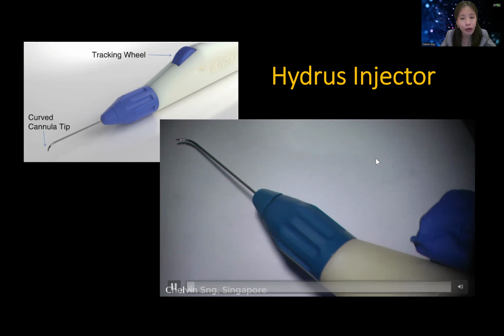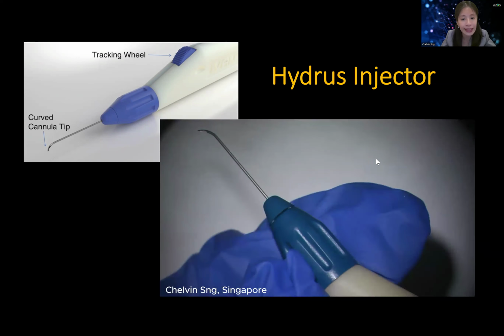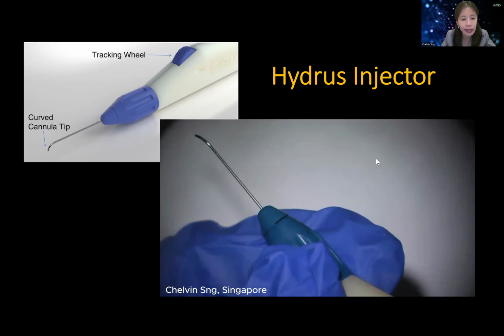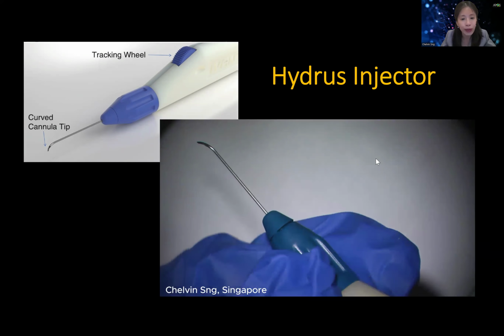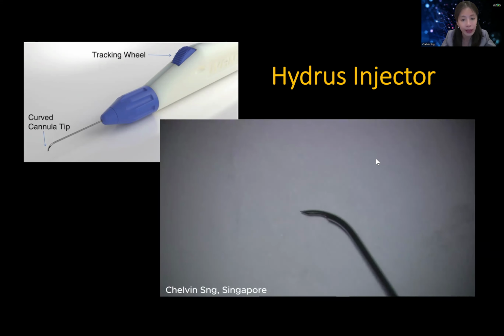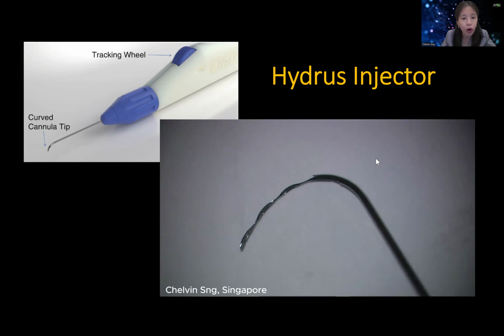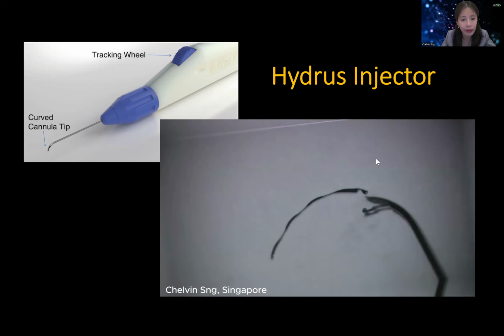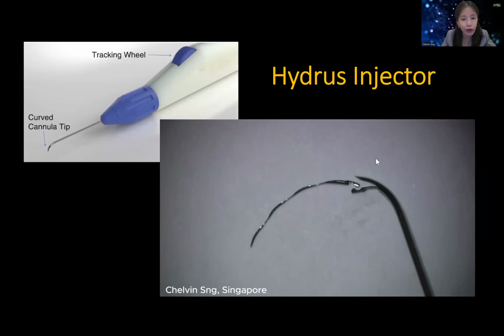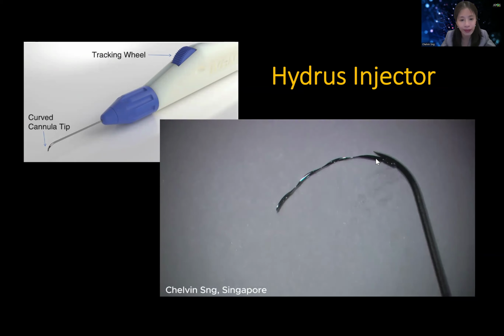And usually I roll it out until I just see the implant, then I retract it until it's just inside the injector. The cannula tip can also be rotated to make it comfortable to turn the wheel with the index finger while still keeping the cannula tip horizontal. Practice pushing the Hydrus all the way out and then re-grabbing it with the injector before your first surgery.